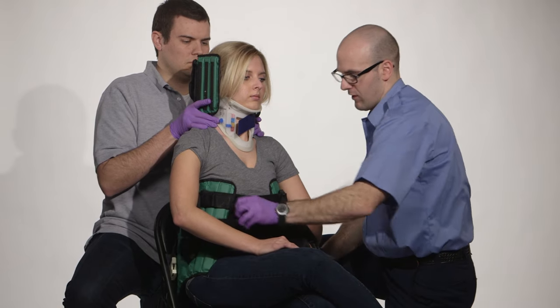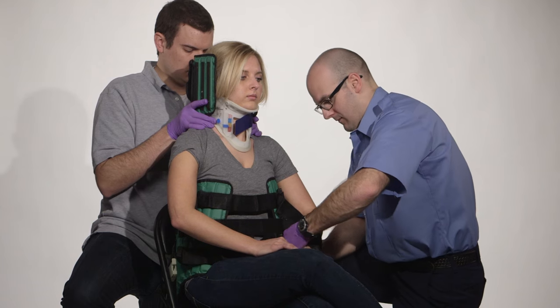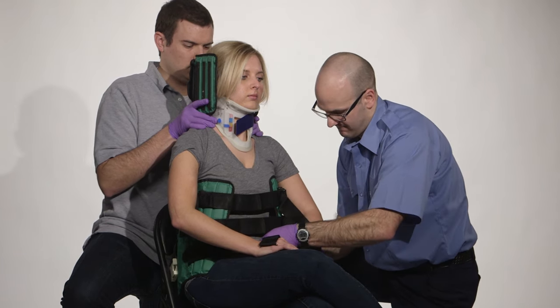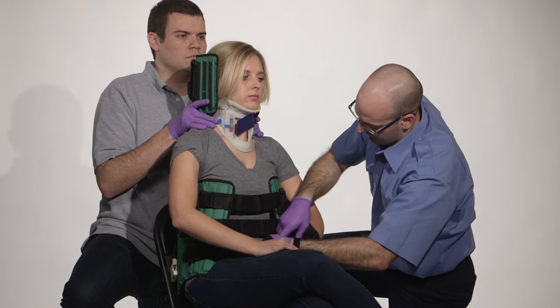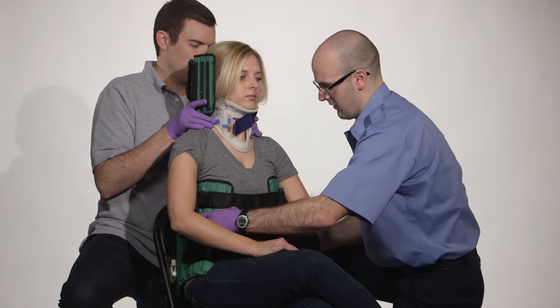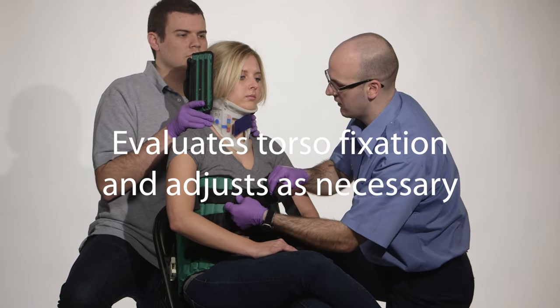Making sure not to move the spine too much as I do this. So now I've got them all connected, I'm going to go back through and tighten them up a little bit more. Can you take a deep breath for me?